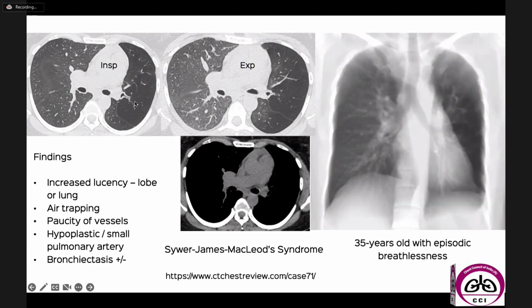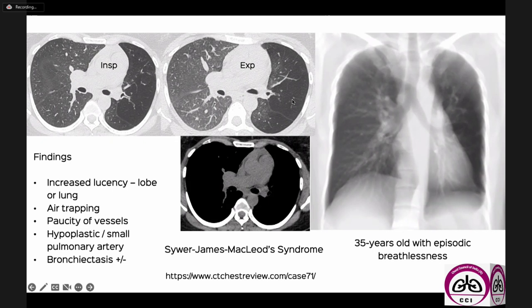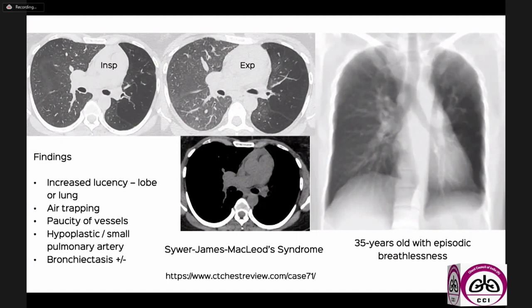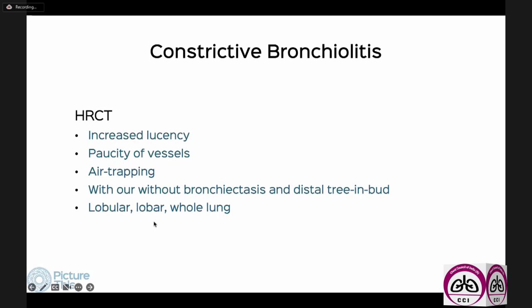When constrictive bronchiolitis involves an entire lobe or lung — as in this patient without much bronchiectasis but with long-standing disease — you can see reduced volume of the entire left lung and a very small left pulmonary artery. This is called Swyer-James-MacLeod syndrome — a very severe form of constrictive bronchiolitis, combining the names of the physicians who described it.